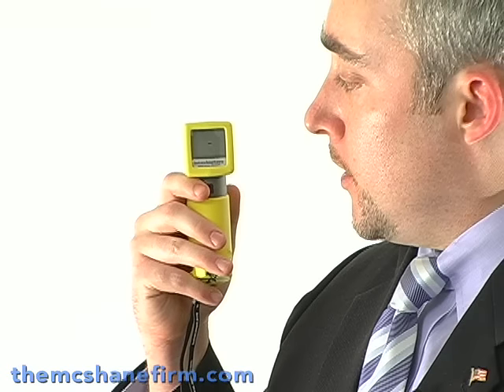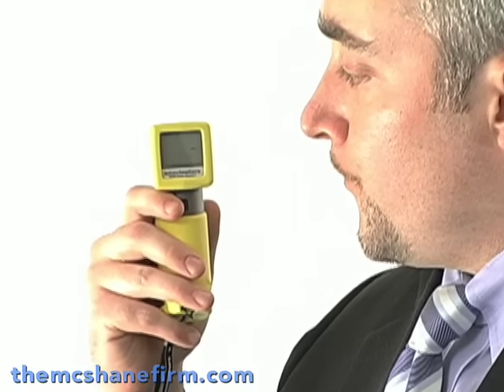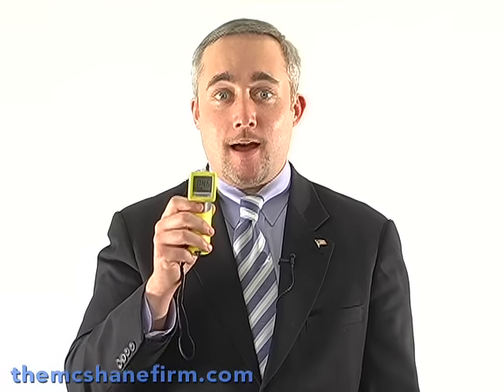Captured sample. It's analyzing. The result is a .046. I couldn't even believe it — I had to look at it twice. That is an extremely high level.